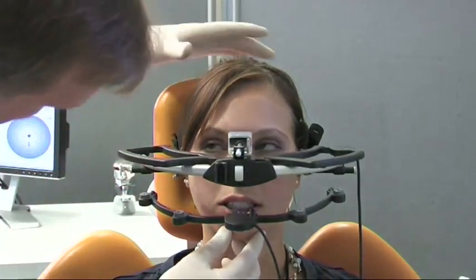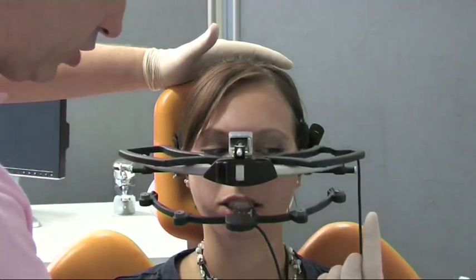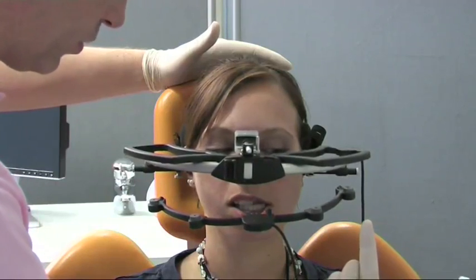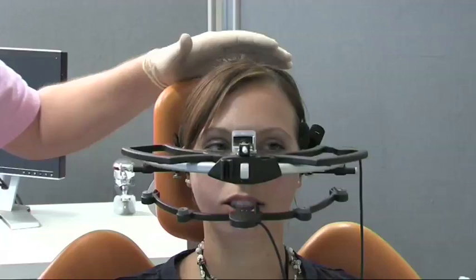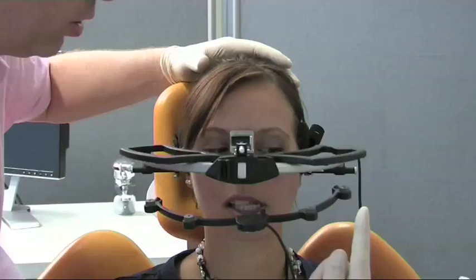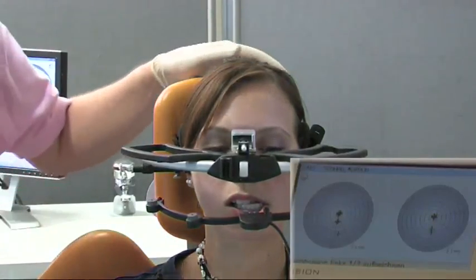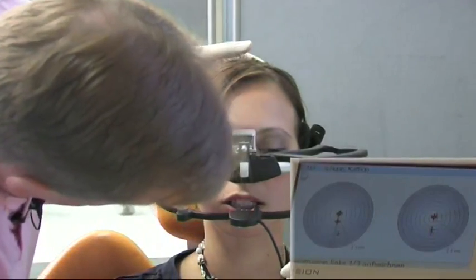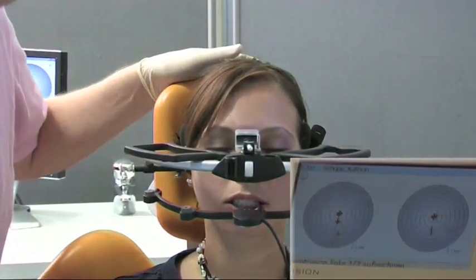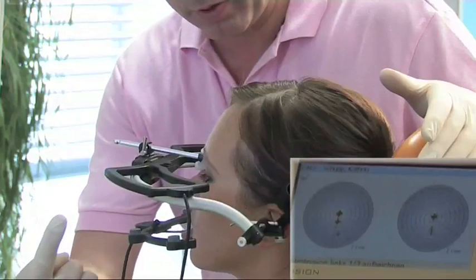I now want you to practice a new pattern of movement. You should not move here to the side where my finger is, but gnash on my finger instead. That's good so. Once again, gnash on my finger. And back. Now the same thing once again. Gnash on my finger and back.